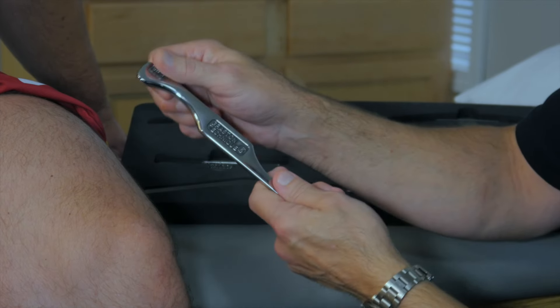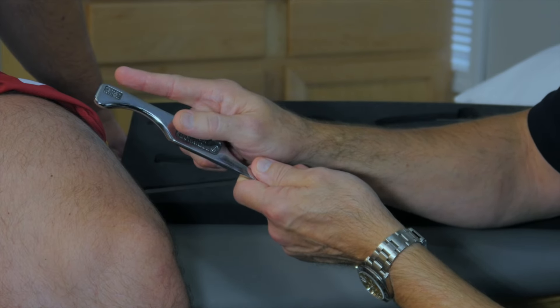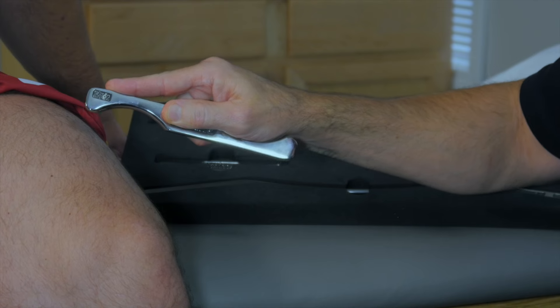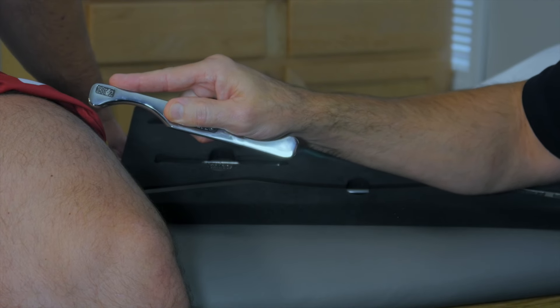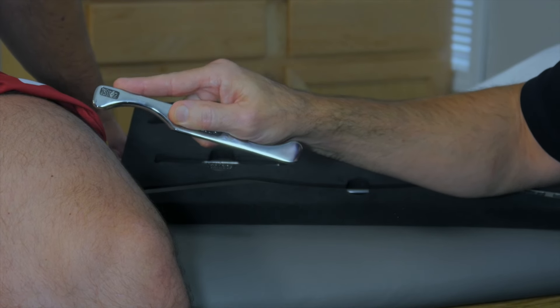For a one-handed grip, we'll pinch the instrument between your thumb, the medial side of your middle finger, and place the index finger across the back edge of the instrument. It's very important to keep your index finger here, both to stabilize the instrument as well as to be able to palpate through the instrument.